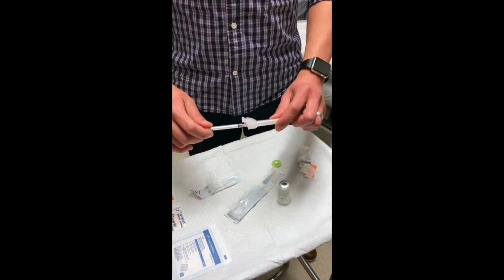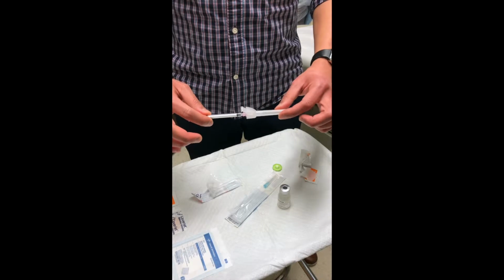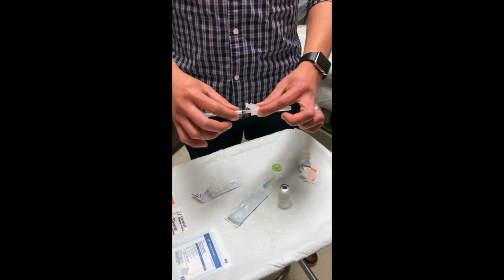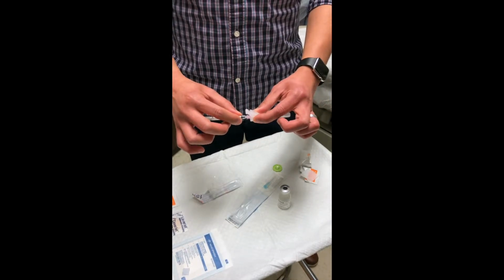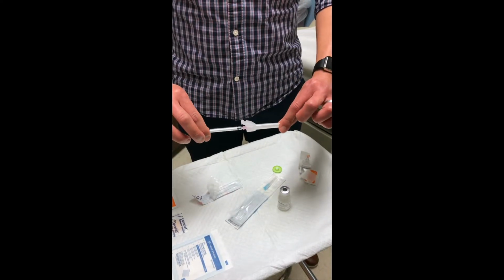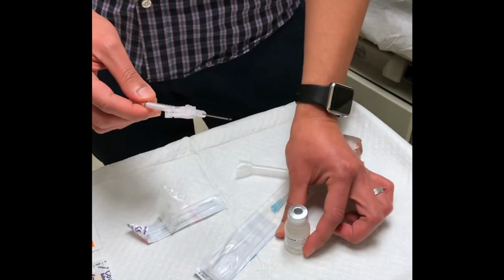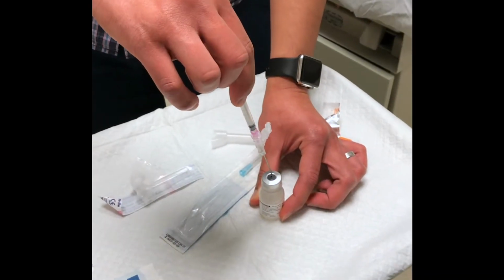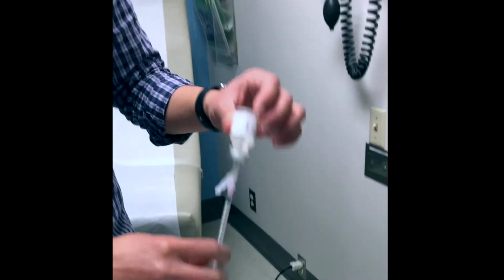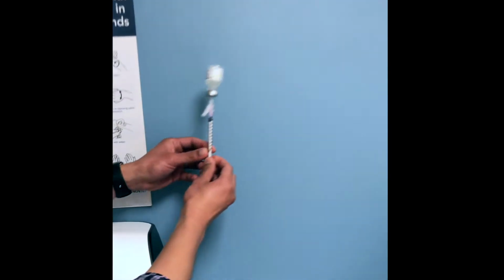All right, so now that the needle is connected to the syringe, you can take off the plastic cap that protects the needle. Sometimes folks like to hold it here, but it's actually pretty unstable at this point. So I like to hold it at the edges and just pull straight back, and that'll expose the needle. What you do is hold the base of the syringe and just jab straight down. So you flip the vial, and then let's take it to the wall, that way you can see it against some contrast with the color.